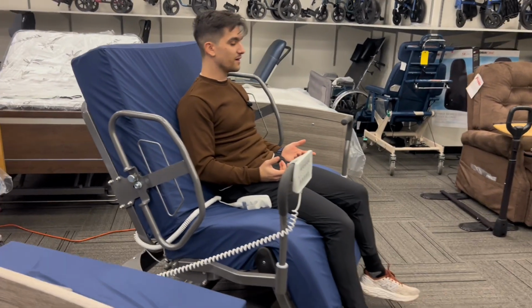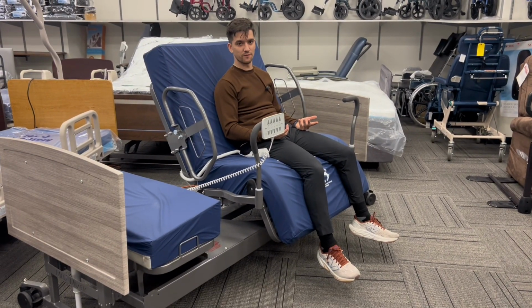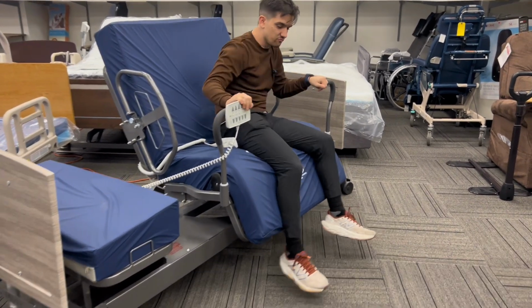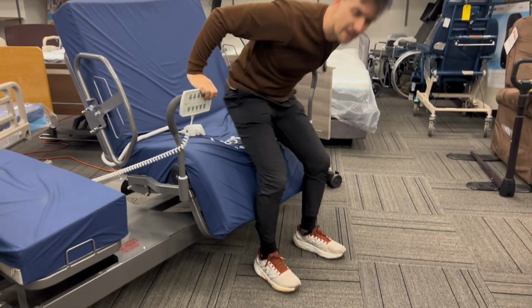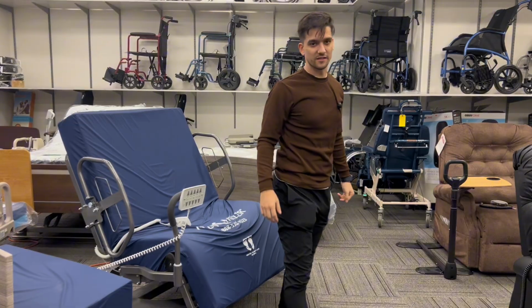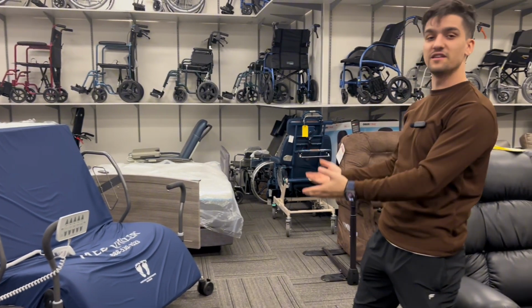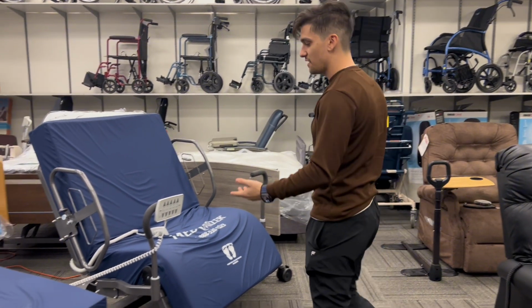So the number one thing I'm trying to address here is the fact that this is not safe for a transfer in and out. So right now, if you were in this position, you'd have to kind of slide yourself forward until your feet reach the floor, somehow balance yourself and have that strength to stand up. It's not that it's not possible. I know they are a lot less money-wise compared to the ActiveCare bed, but it's just a certain perspective of safety that we're looking at and quality.